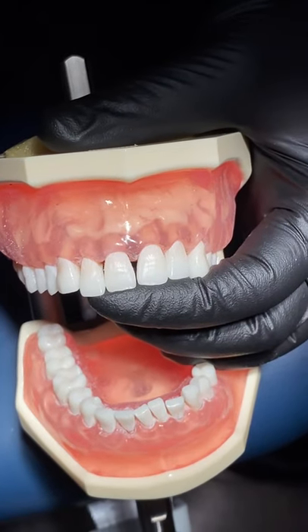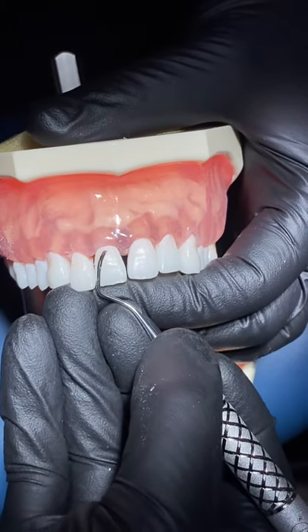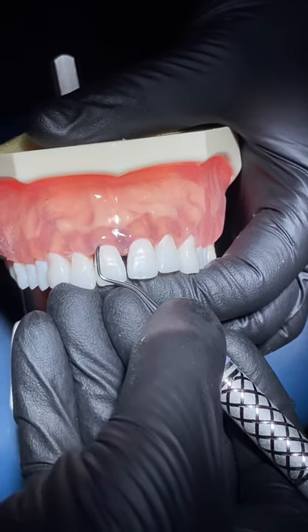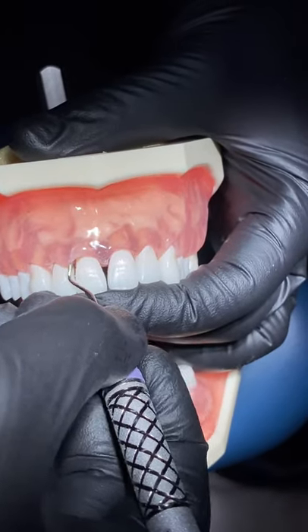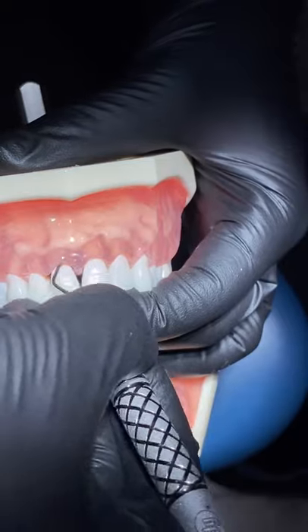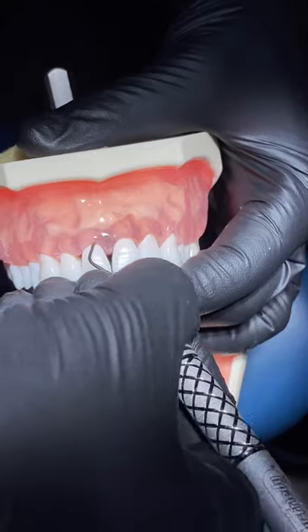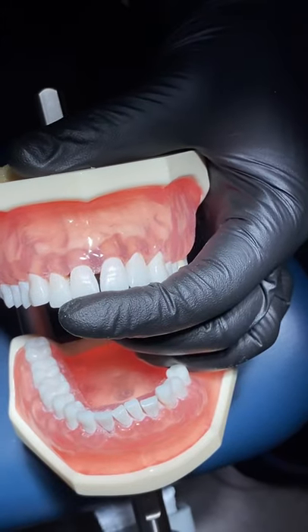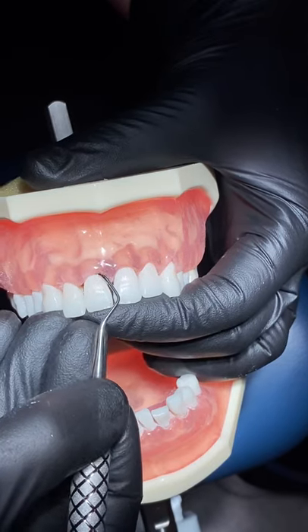Same as with the posterior — when we insert we want to close our blade to zero degrees towards the tooth, and then open our blade up once we're subgingival to 70 to 80 degrees in order to instrument the root surface. As we're instrumenting subgingival, we want to keep that blade underneath the tissue until we've completely instrumented the entire surface.